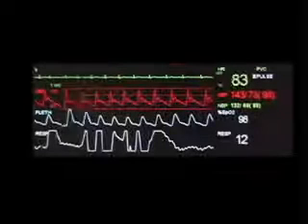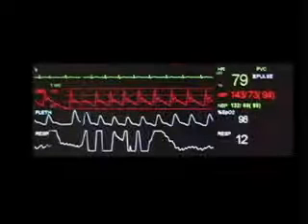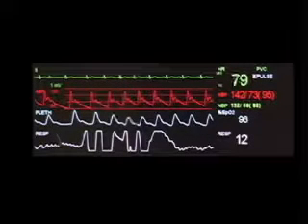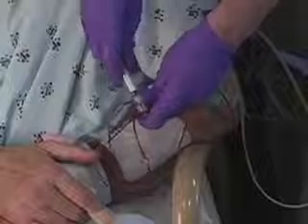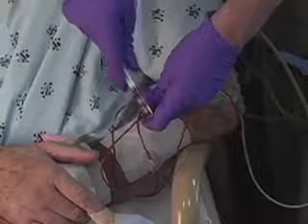Placement of an arterial line is indicated for continuous monitoring of arterial pressure and direct arterial blood sampling.